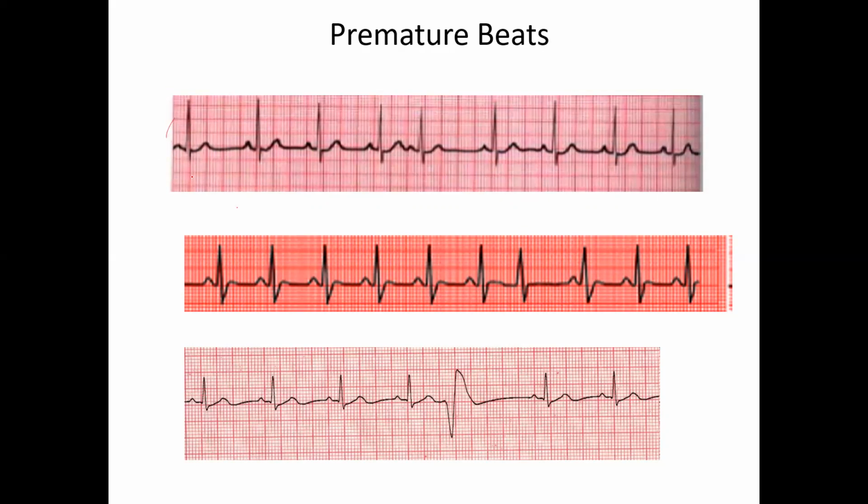All right. So let's take a look at this one on top. Again, left to right, you see the cadence, cadence, cadence, and then it changes right here, right? It changes right there. So this came early, then there's a slight delay, and then it goes back. So this is a premature contraction, and this is atrial. We don't really say premature sinus contraction, just realize it's always going to be coming from atrial or junctional. So this is a premature atrial contraction.